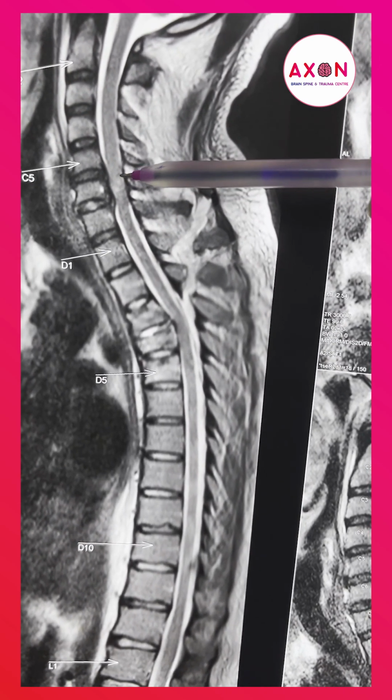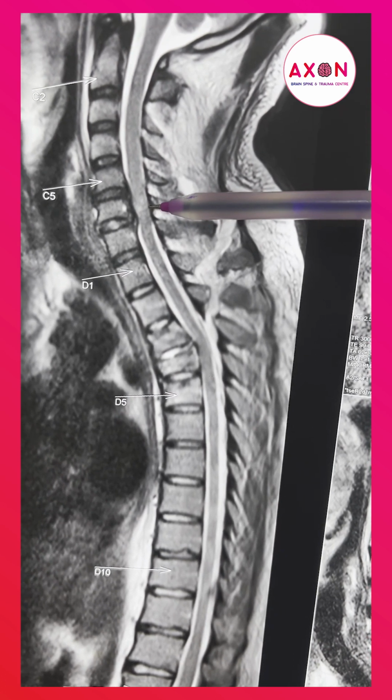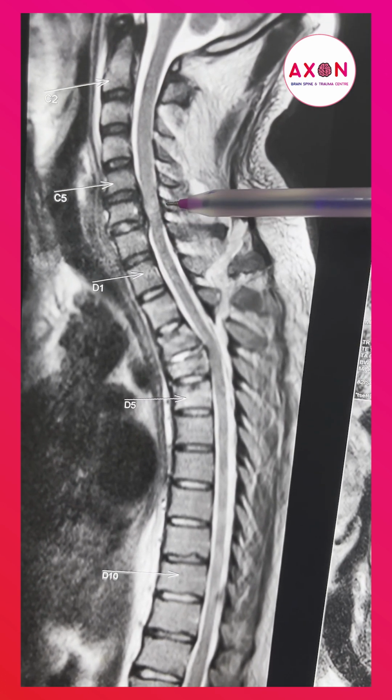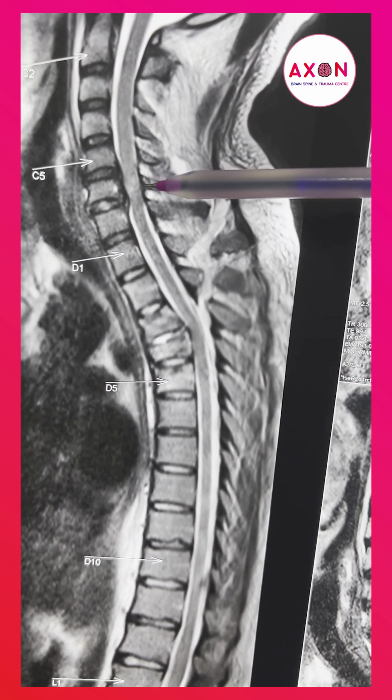Here on the cervical level, you can see this whitish signal at the cervical cord. This is because of the post-traumatic cervical cord compression. You can see there is a cervical canal stenosis component also. Because of this, he has bilateral upper limb weakness, more prominent on the right side.